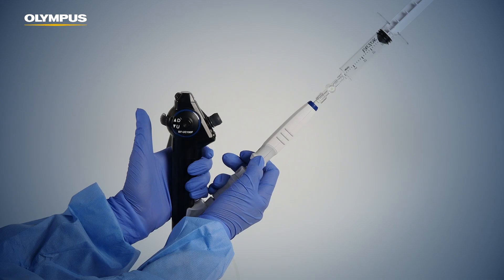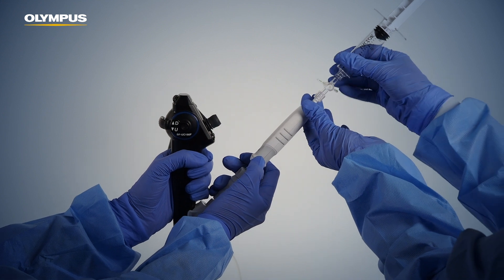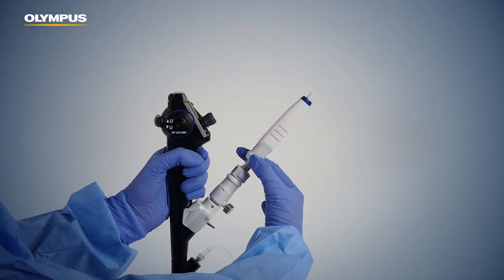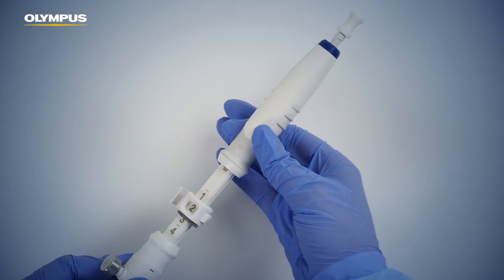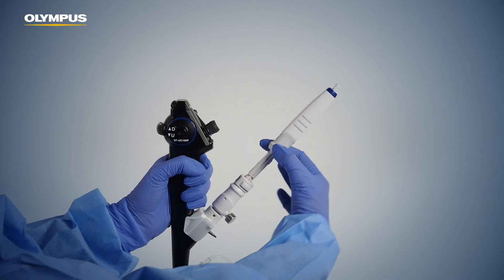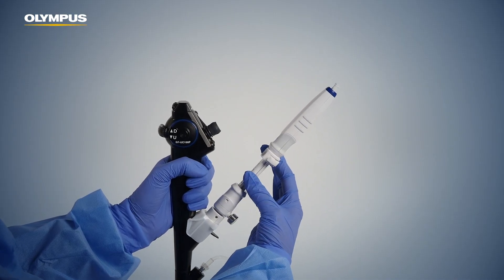Before withdrawing the needle system from the endoscope, ensure that the following steps are completed. Straighten the endoscope completely. Fully retract the needle slider until a click is heard. Confirm that you can see the control line on the needle scale. Securely fix the needle slider using the needle adjuster lever in order to prevent accidental exposure of the needle.